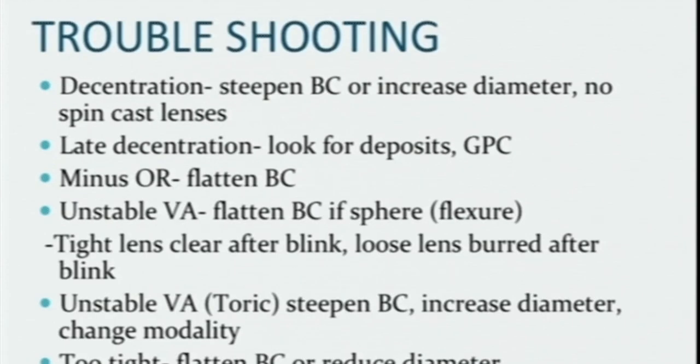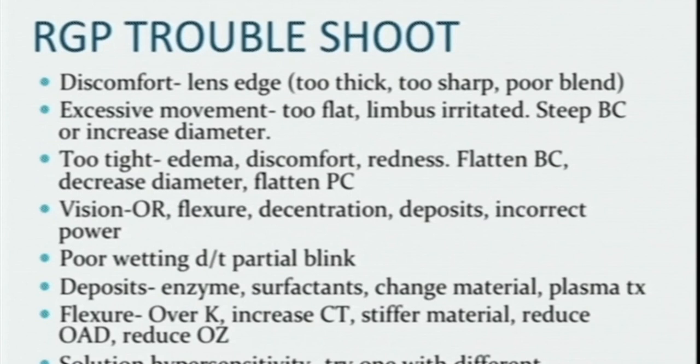Decentration, I already talked about, late decentration, early decentration, and unstable visual acuity. And in cases of RGP lenses, discomfort, the lens edge might be too thick, and excessive movement means it's too flat. The same thing, deposits also should be taken care of.